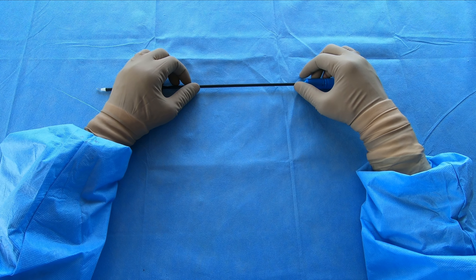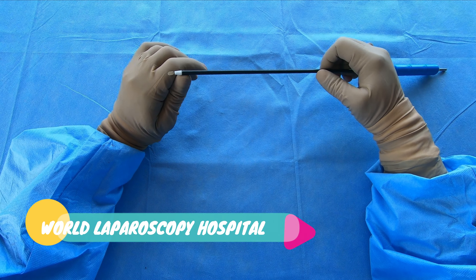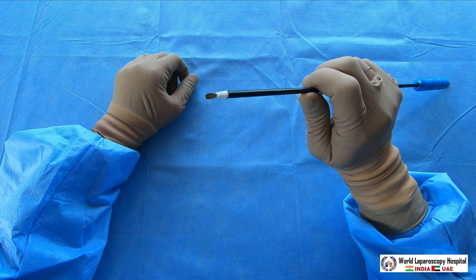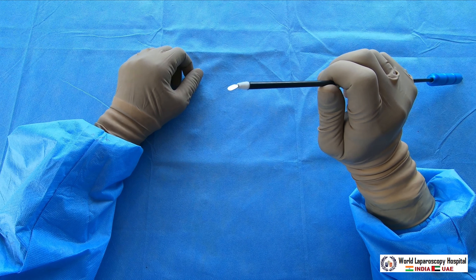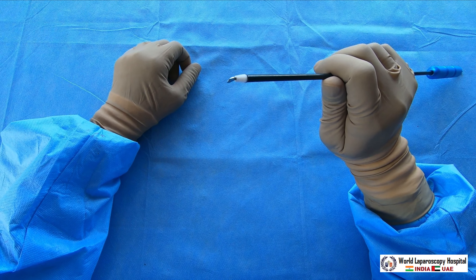Hello friends, today I am going to demonstrate a very useful instrument called the spatula. This spatula is a very good instrument which is useful for laparoscopic surgeons for fulguration.